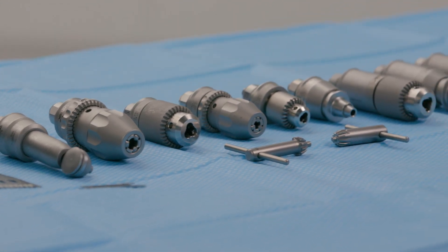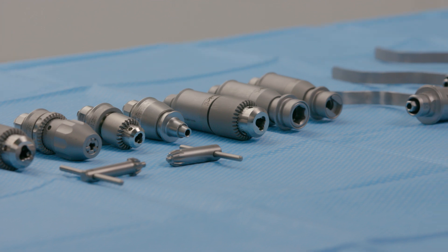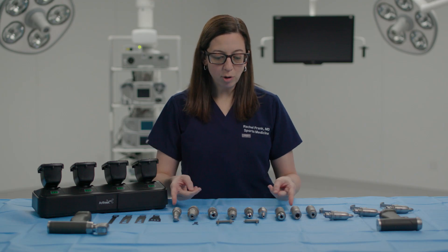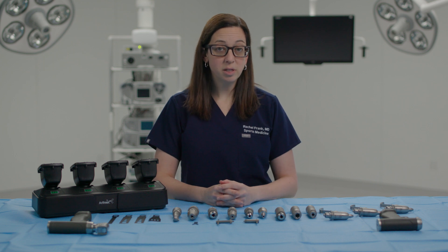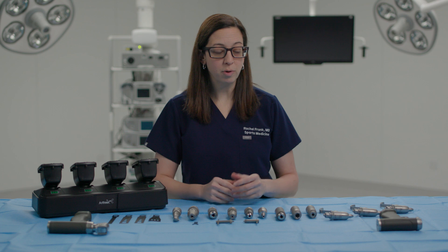Synergy Power includes a comprehensive attachments portfolio for all drilling, reaming, sawing, and burying needs. The system will offer keyed and hybrid drill chucks and three different sized wire and pin drivers for optimal wire or pin retention.